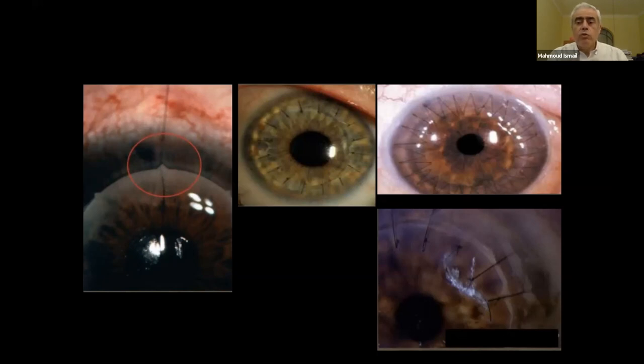Now, we go to the coaptation, which is something else. Coaptation means both tissues are almost alike on the surface, because when we suture the graft, you are taking care of the surface only. Inside, one of them is thicker than the other, or one of them is not matching with the other, but you are caring for the surface. What you are doing is to approximate the surface of the donor to the surface of the recipient.